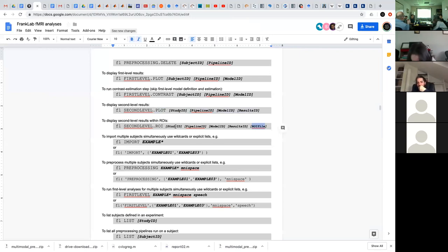Do we not have, so you don't do that at the first level, right? You do everything, you do either surface-based or voxel-based estimates, and then it's going to take those ROIs and extract the mean beta. Exactly, yes. ROI for each subject. And is that individual data stored though for each ROI? So if you want to do something like plot the ROI.